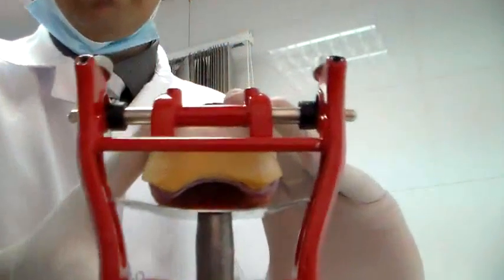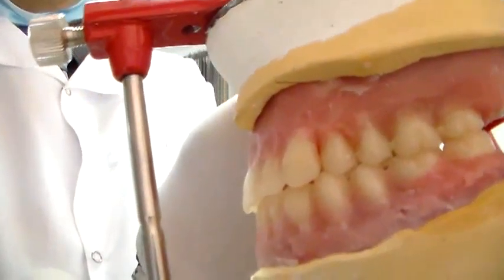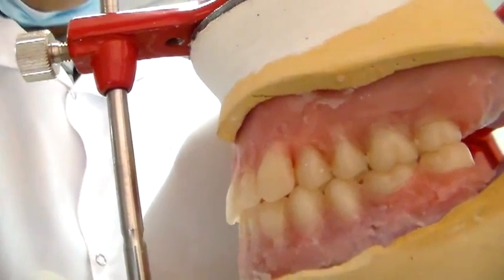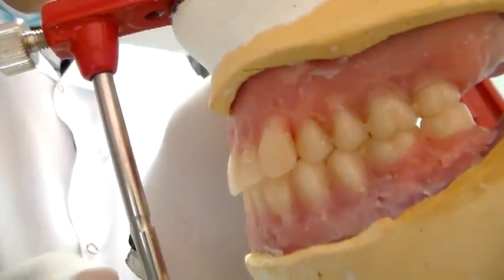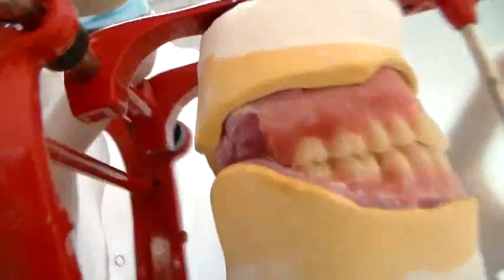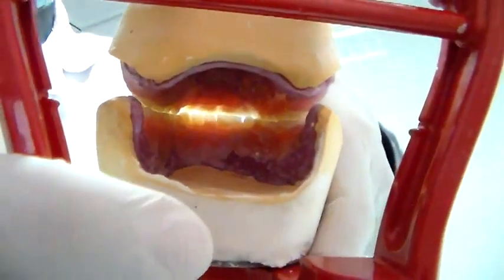Now, having verified this, you want to check for the posterior portion of your denture — this is to check for the occlusal aspect. From the buccal aspect, you want to check if the occlusion looks good and if all the teeth are interdigitating. Sometimes, depending upon the teeth sets, you may have some amount of space between teeth, but basically there should be good interdigitation on the other side as well. Now, the most important part is to verify the occlusion from the posterior.